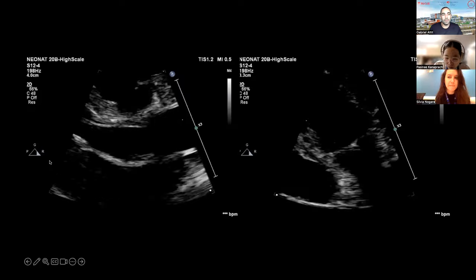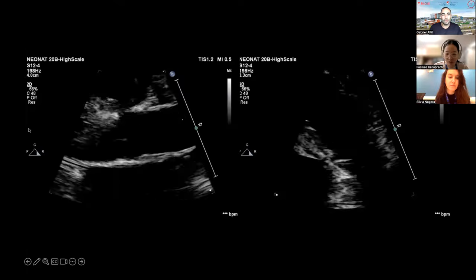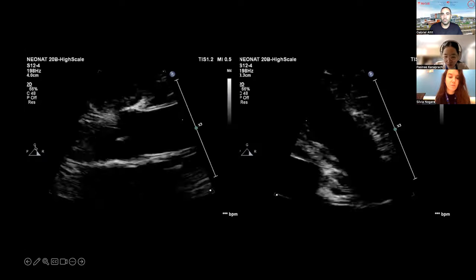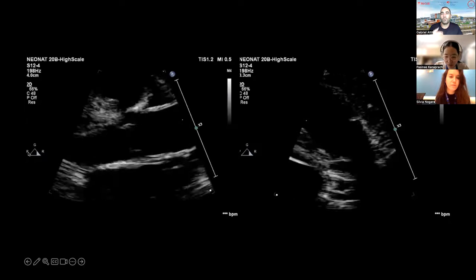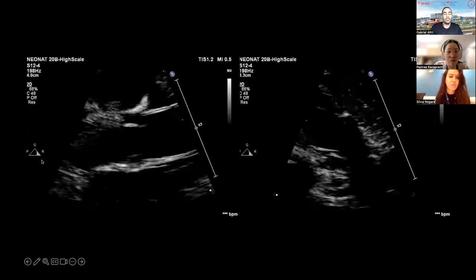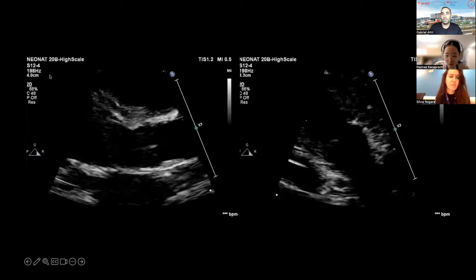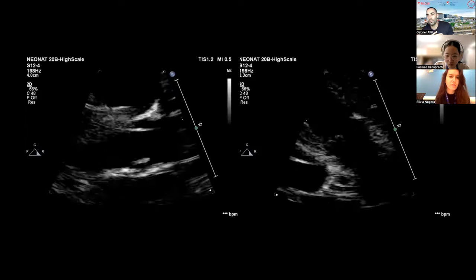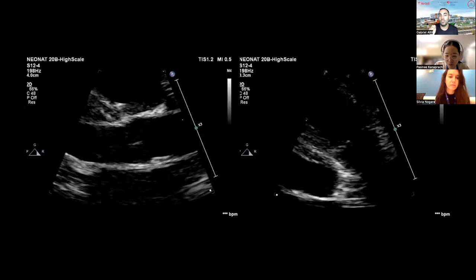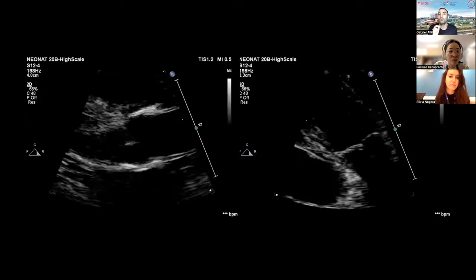And then on the bottom is the type of megahertz you're going to use for your probe. So R means resolution, G is for general, and P is for how profound you are, so the depth. In the Philips system, if you're going towards more resolution, it's going to use much higher frequencies of the probe, because you're looking at very superficial structures, and it's going to give you more resolution, but you're losing in depth. In some of your probes and your machines, you're also able to control the actual range of hertz you're going to be using of your probe.